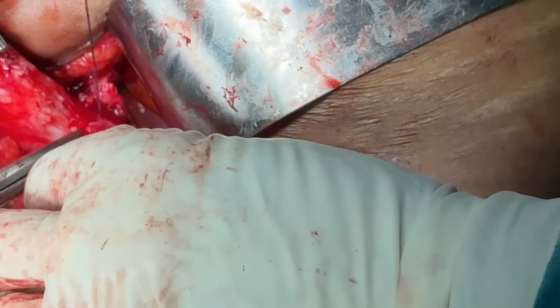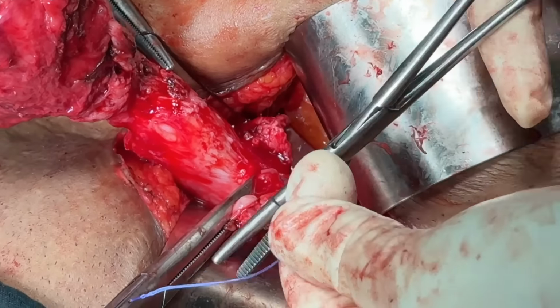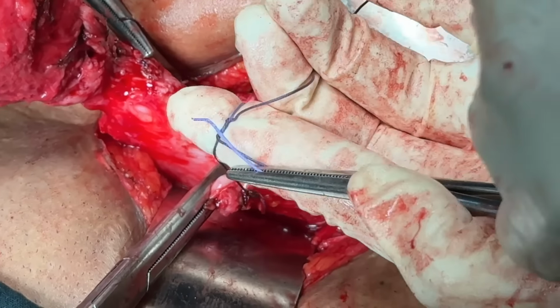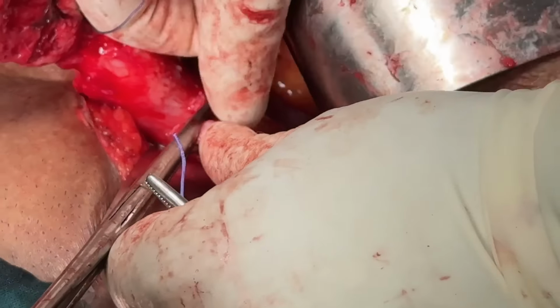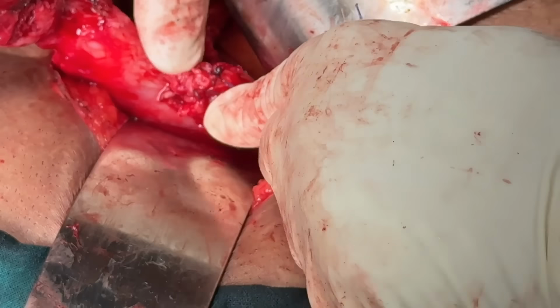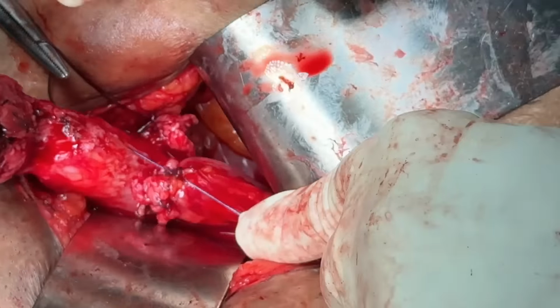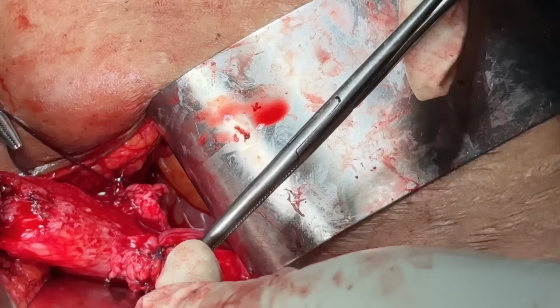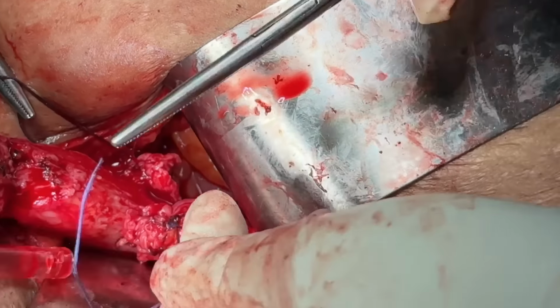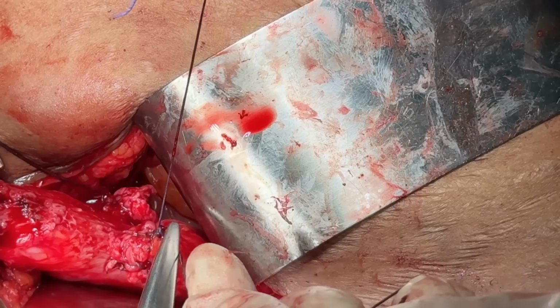Do you want to understand the knot again? Loop the longer end on the index finger and take the shorter end 2 times through this loop. Change your hands to get a squared knot, and then while the assistant is releasing the clamp, you tighten your knot, and then second knot and third knot. I'm just putting a fourth knot and a fifth knot to show you how it is done, but trust me, 3 knots are more than enough.